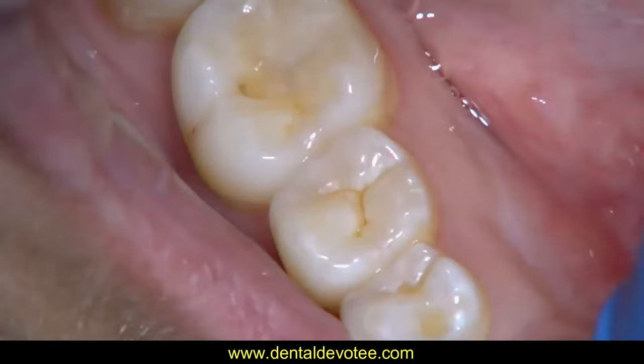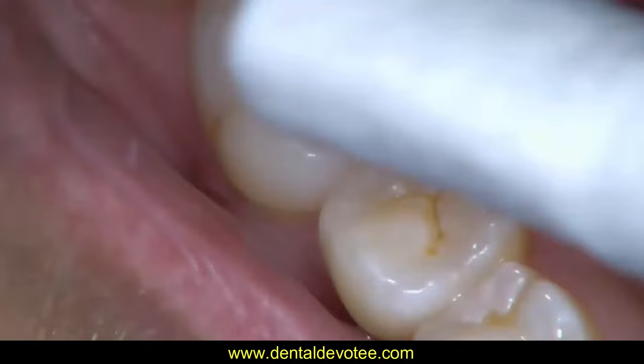First, isolate the tooth using cotton wool, dry tip, saliva ejector, with rubber dam if possible.